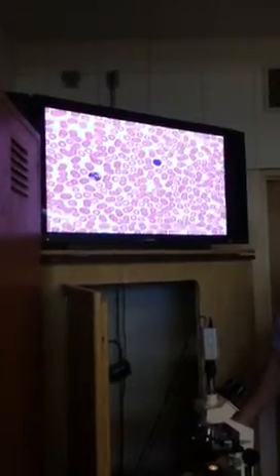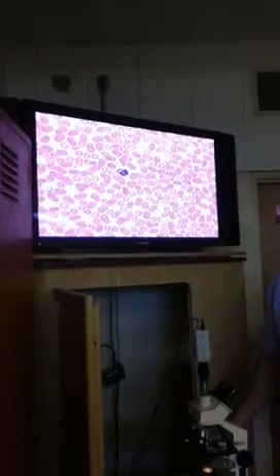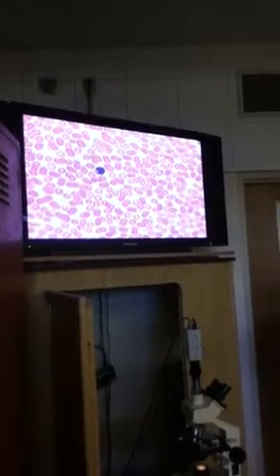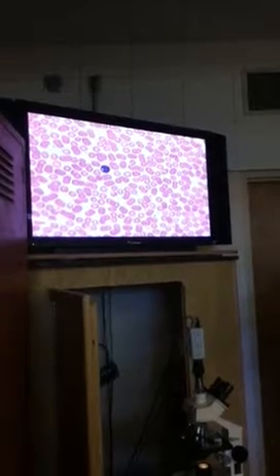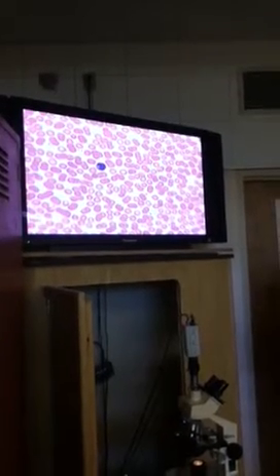So you kind of look around here and see if you can pick up any more of these. Because they'll throw some up here that's somewhat atypical, so we're not going to use it. All right, here's a good one. There's one. Based on the nuclear shape, this should be easy to tell what this is. If you look on your textbook, this is a monocyte. We call it a fat C or a fat U, depending on which way it's actually positioned. But it's very distinctive in its nuclear shape, so it's easy to see this is a monocyte.